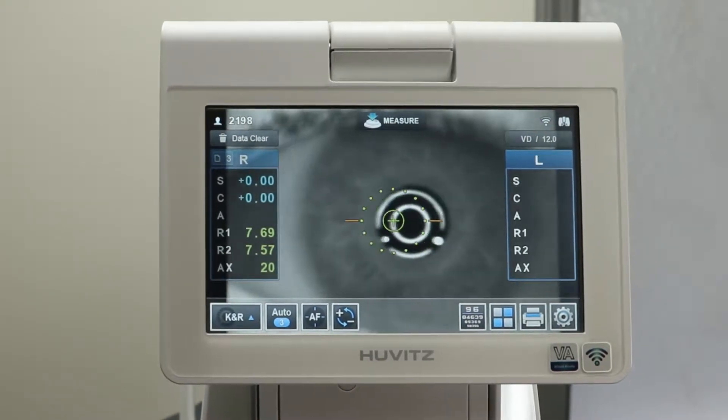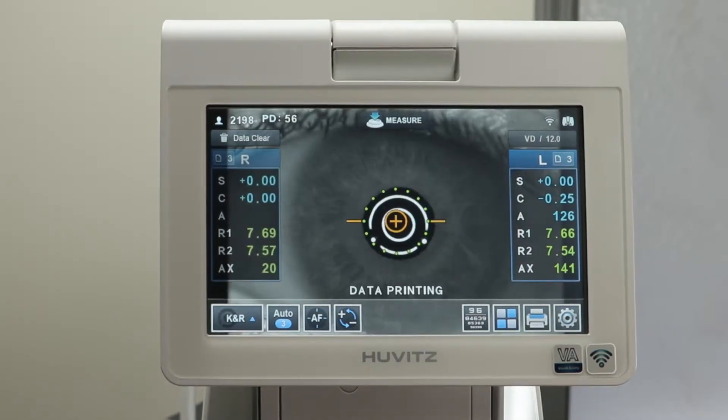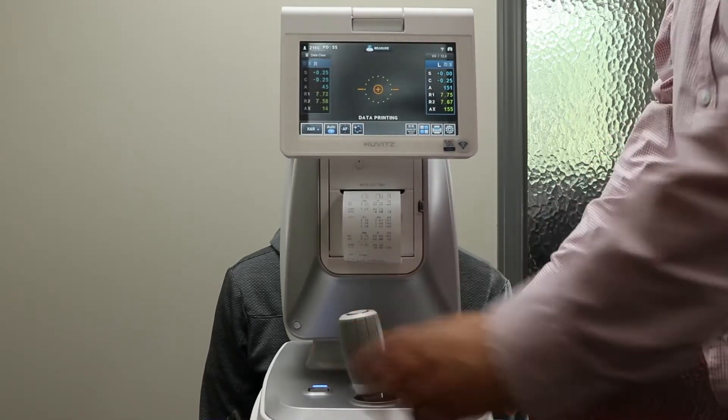Screen prompts will help guide you on how to line up your pupil properly. After the refraction is done, it will print a readout of the exam and send the information via Wi-Fi to your digital refractor.